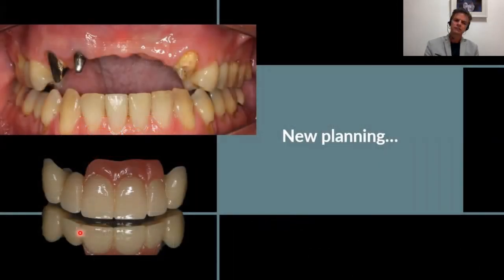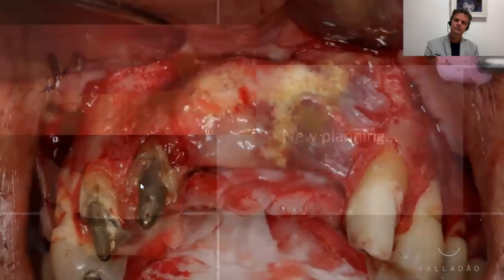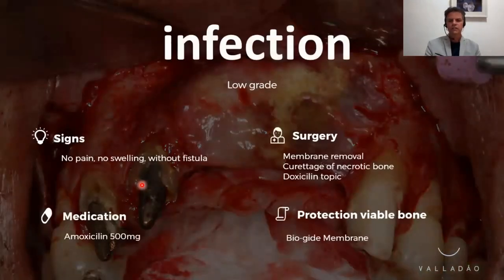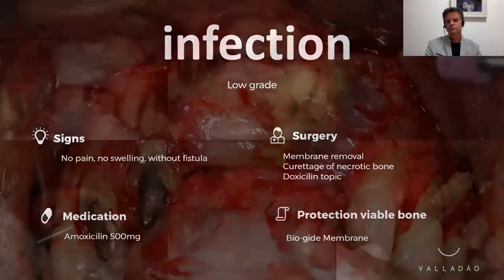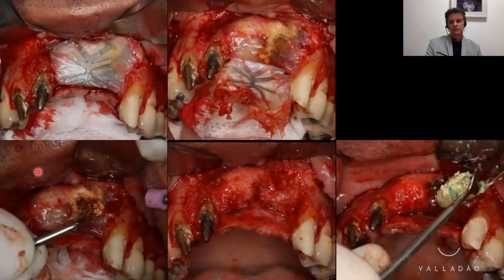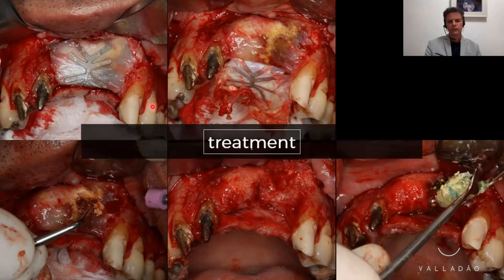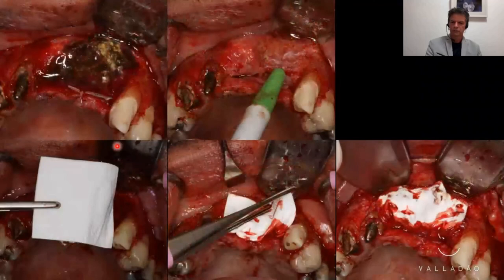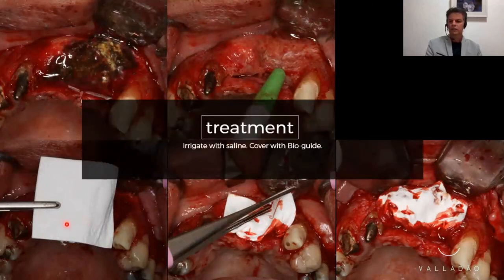We had to start all over again and do new planning: redo the fixed prosthesis with artificial gingiva, and likely perform a new GBR procedure. According to Urban's classification, what was happening was a low-grade infection. We prescribed amoxicillin 500 mg three times a day and performed surgery following the proposed protocol. The treatment involved removal of the membrane and the necrotic-looking graft — which had a grayish coloration with loose particles. The site was irrigated with saline solution, doxycycline paste was applied for three minutes, then washed off with saline again. The viable graft was then protected with a Bio-Gide membrane. We believe we could save approximately 60% of the graft.